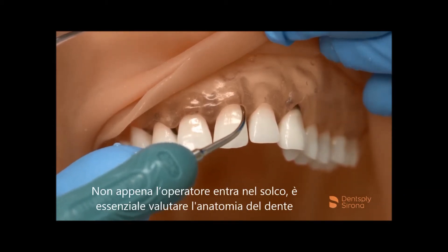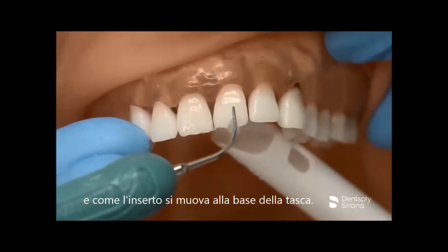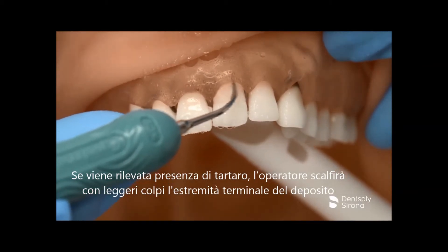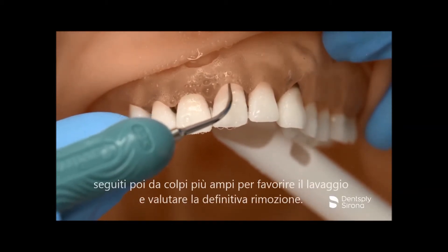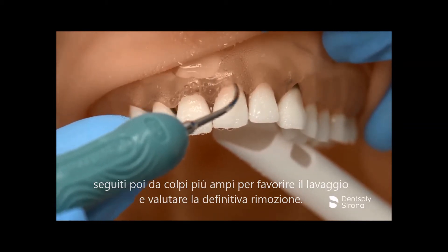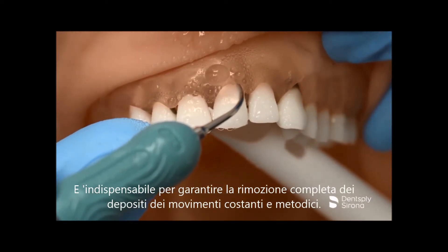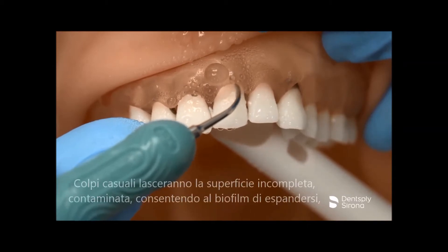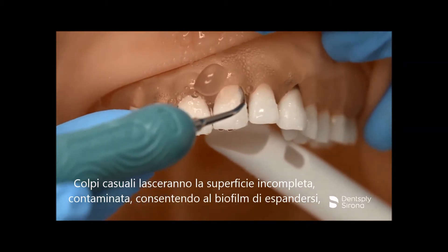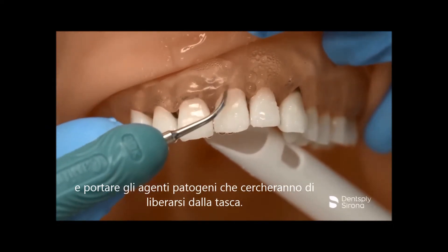As the clinician enters the sulcus, it is essential to assess the anatomy as the insert travels to the base of the pocket. If calculus is encountered, the clinician engages the terminal end of the deposit in a light tapping approach followed by small sweeping strokes to provide lavage and assess the removal. It is imperative to ensure complete removal by producing a stroke pattern that is overlapping and methodical. Haphazard strokes will leave the surface incomplete, contaminated, allow for biofilm to attach, and harbor the pathogens we are attempting to rid from the pocket.